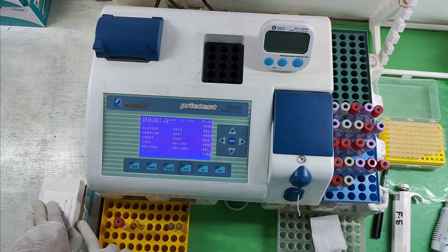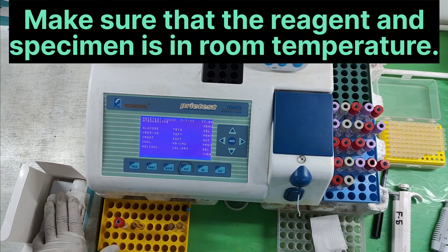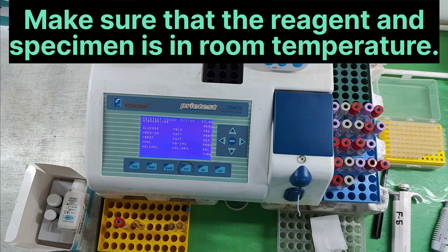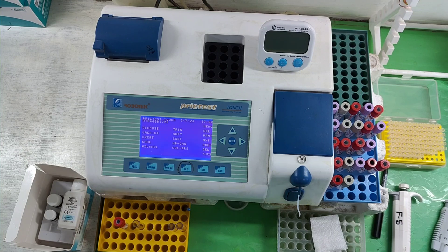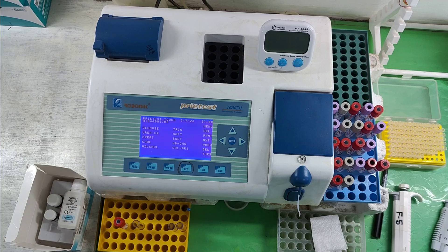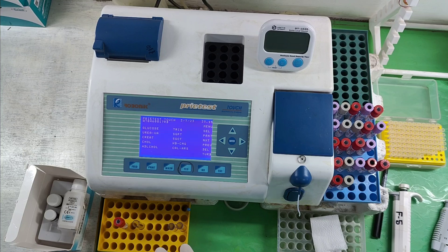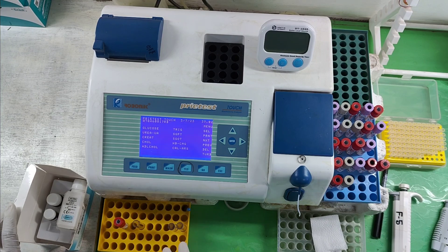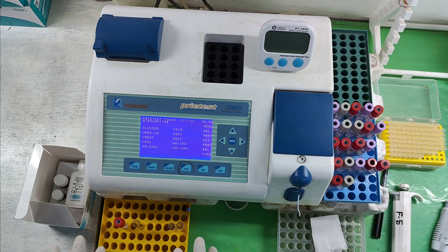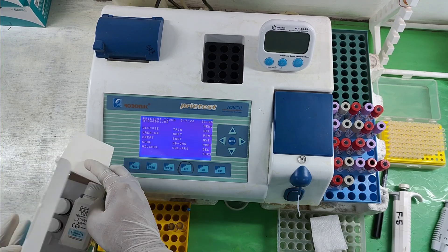First of all, make sure that the reagent is at room temperature. With a frozen sample or frozen reagent, you should not process the test, because false positive, false negative, or falsely increasing or falsely decreasing values may be generated. That's why we have to use room temperature samples and reagents.